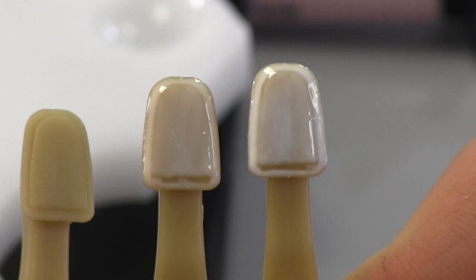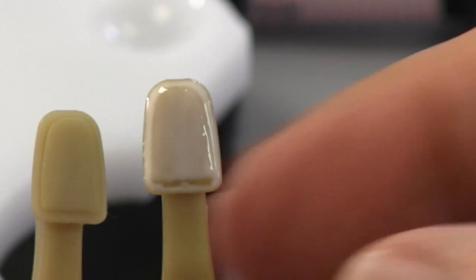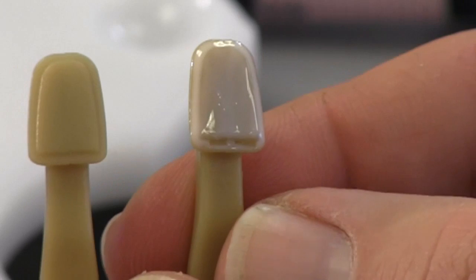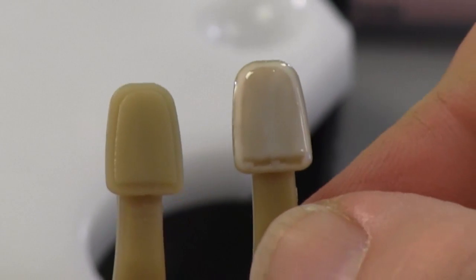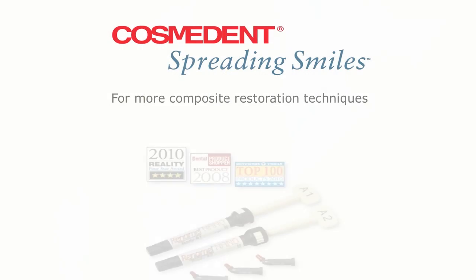So we can conclude from this exercise that Pink gives you more natural, lifelike restoration, all by keeping the value up and by giving you a warmer looking restoration.